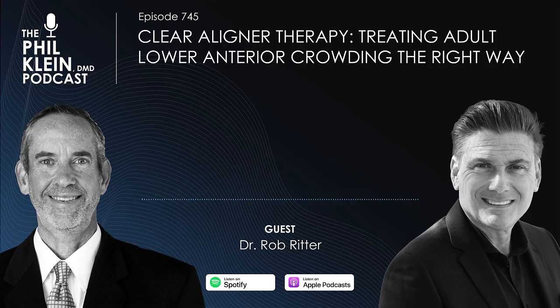That's my cutoff point. Whenever there has to be an extraction involved, I don't like doing those cases. And who tells you there's an extraction necessary? Do you rely on AI for that, or do you make that decision? I kind of look at it myself. I can confirm it with the AI, but the other advantage that I do have, let's face it, is the orthodontist next door.